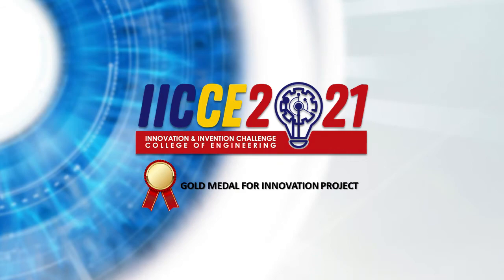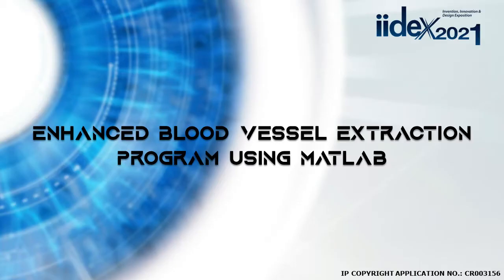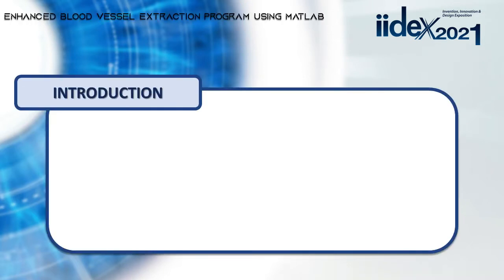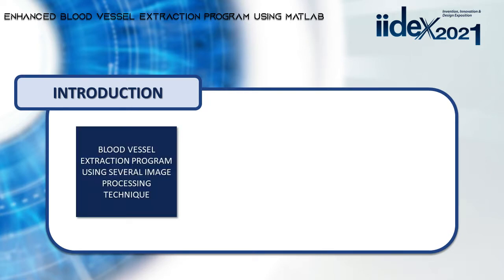This is the presentation for the Invention project titled Enhanced Blood Vessel Extraction Program using MATLAB. As for the introduction, blood vessel extraction programs have been developed and designed by various researchers using several image processing techniques because it refers to the retinal image with the blood vessel architecture.